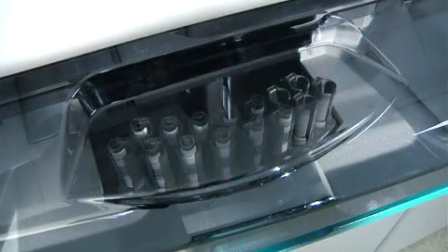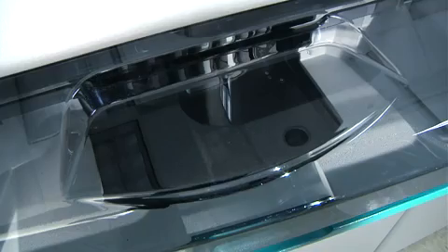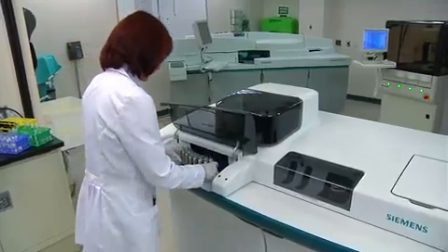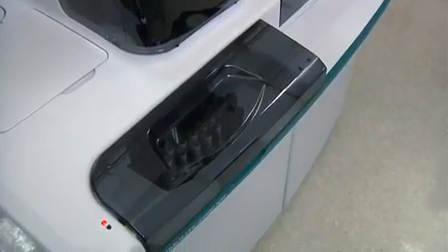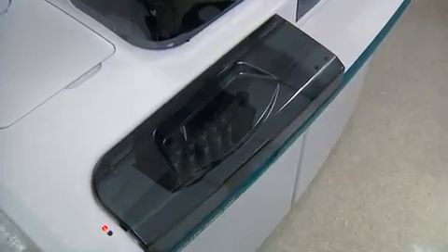A safety door is closed between the Auto Rack Load door and the sample carousel. As long as space is available on the sample carousel and the indicator light is green, additional racks can be loaded. The red light indicates the sample carousel is full and unable to accept a new sample rack, or the instrument is not in ready state to receive a new rack.